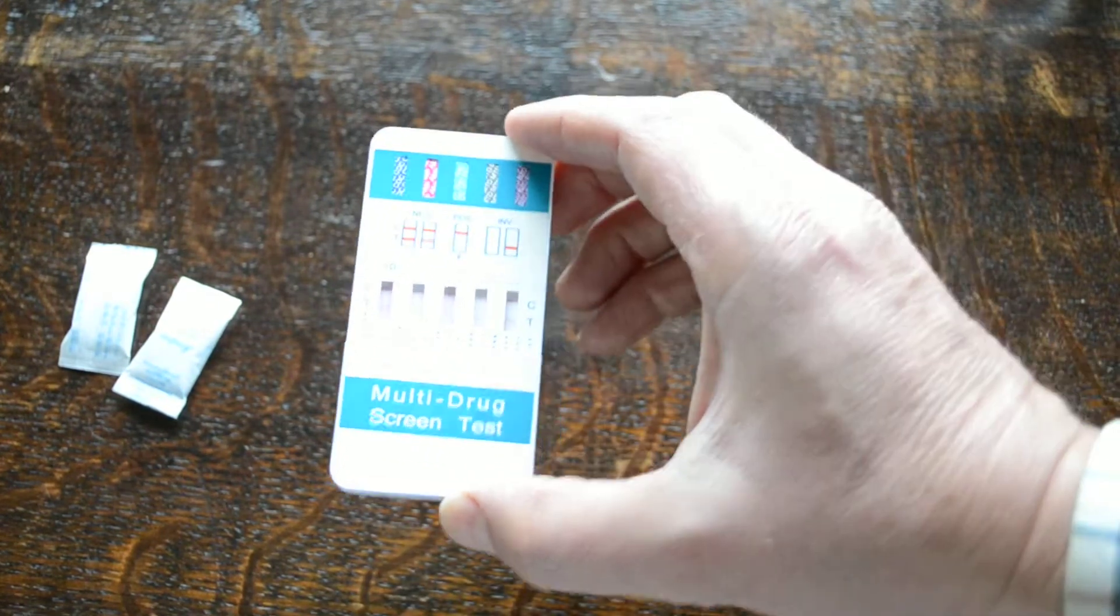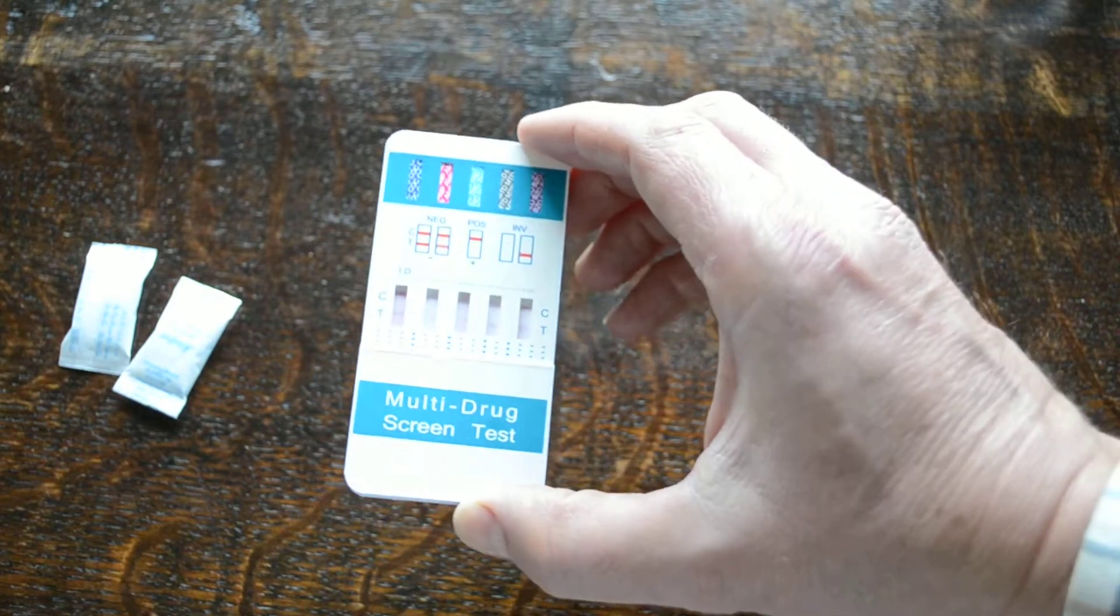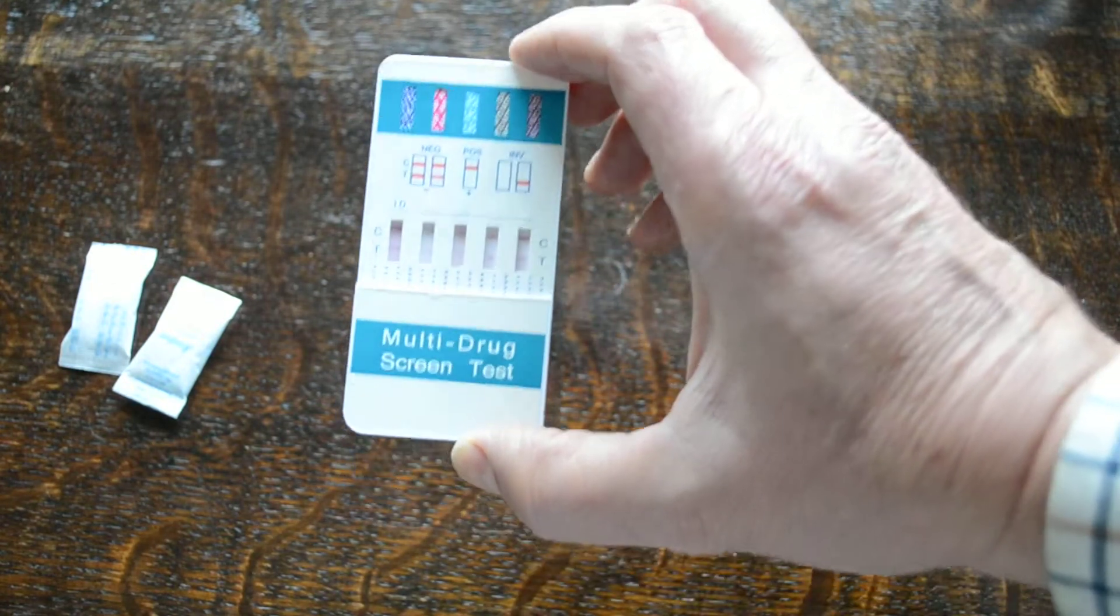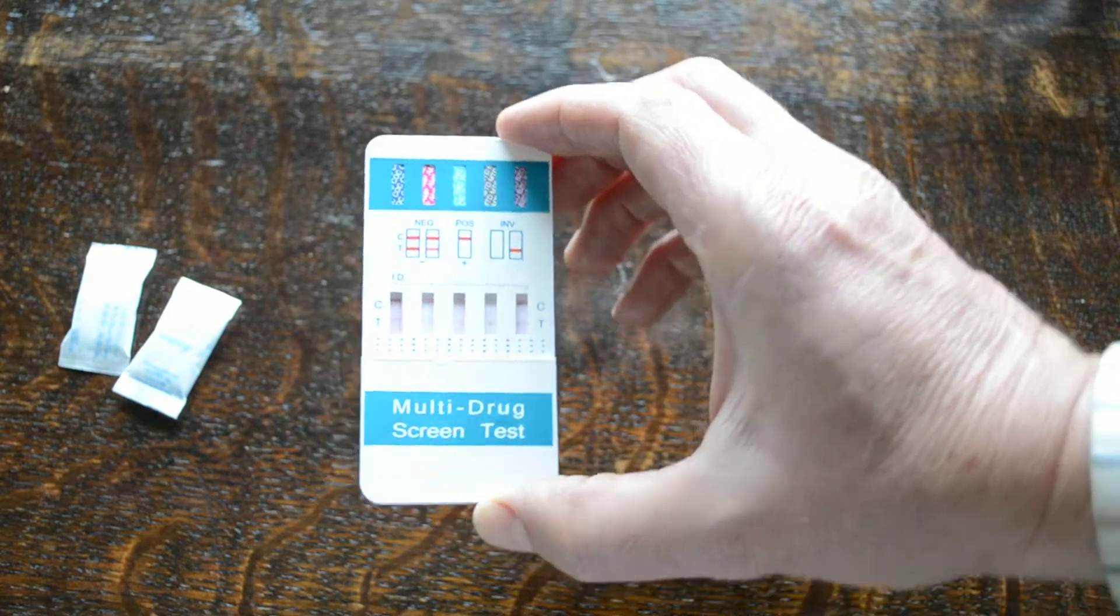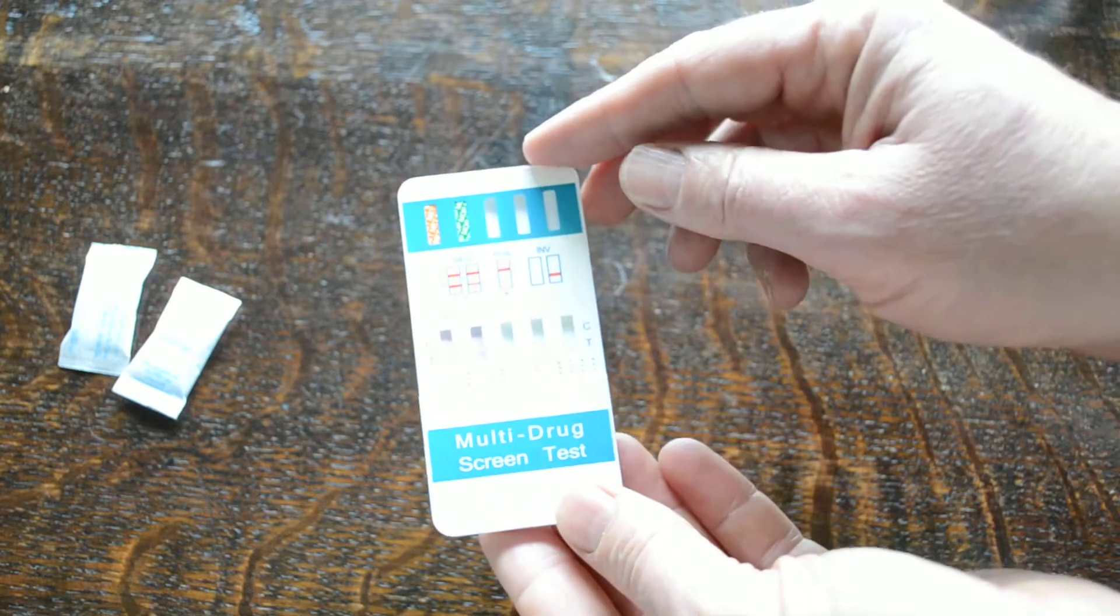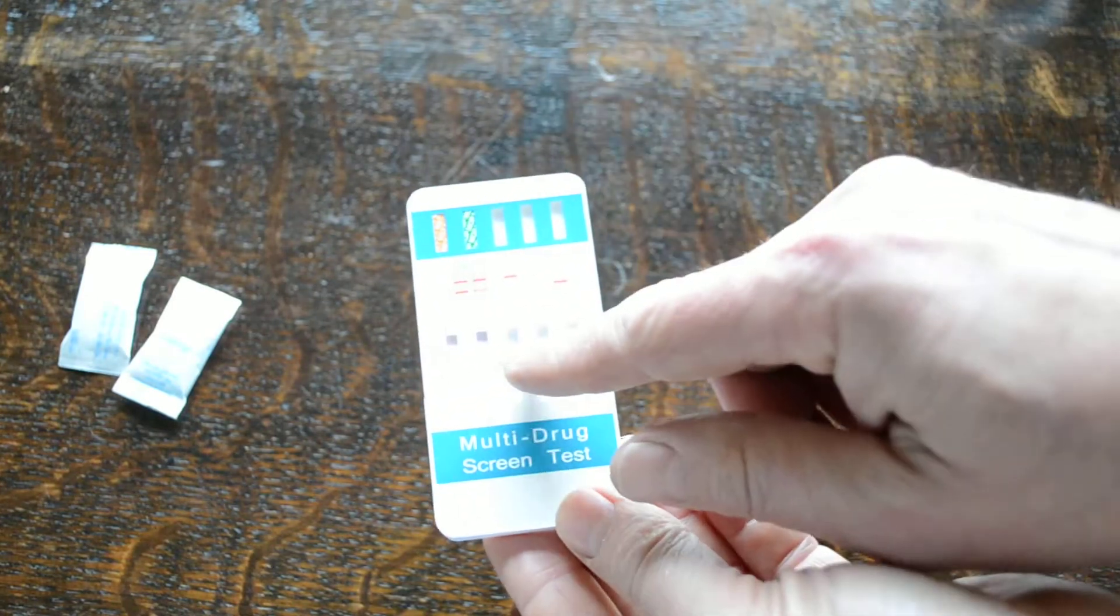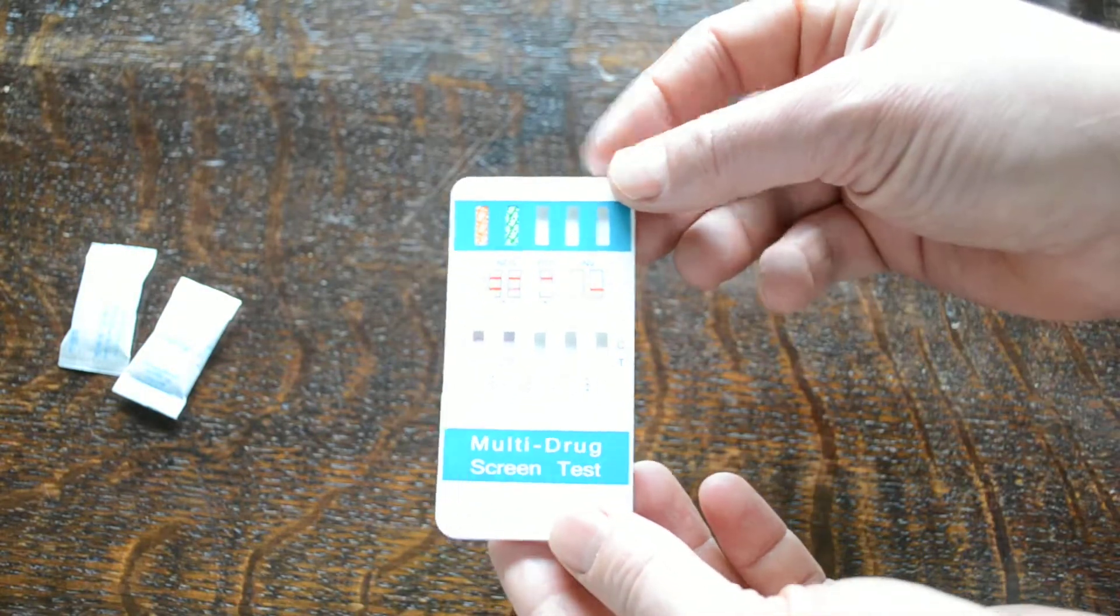Now already I can start to see, even though the back membranes haven't cleared on this one, you've got control lines showing on all five of those and test lines showing on all five. So the cocaine, amphetamine, THC, methadone, and benzo strips are all negative. Turn it over and again on this reverse you've got the two further negative results with test lines and control lines showing on the methamphetamine and opiates.